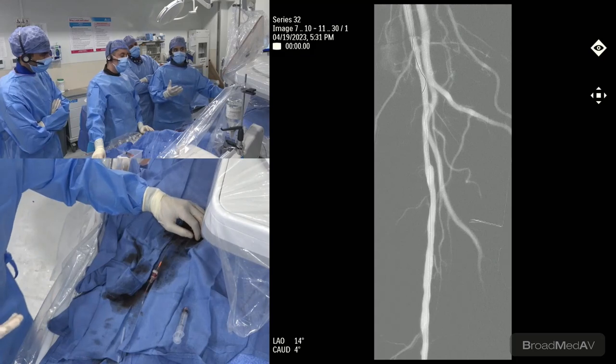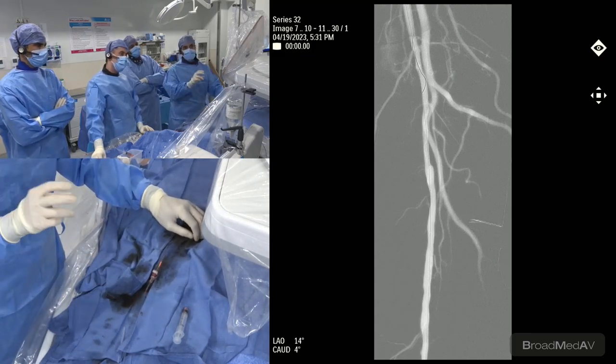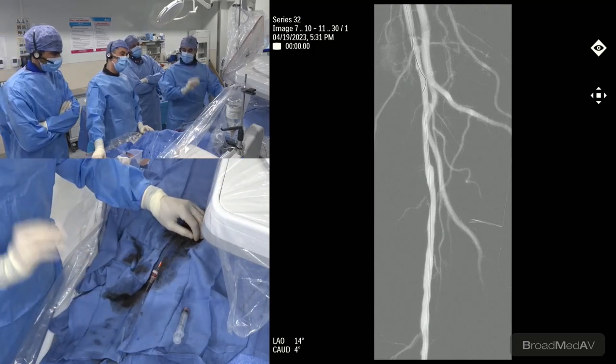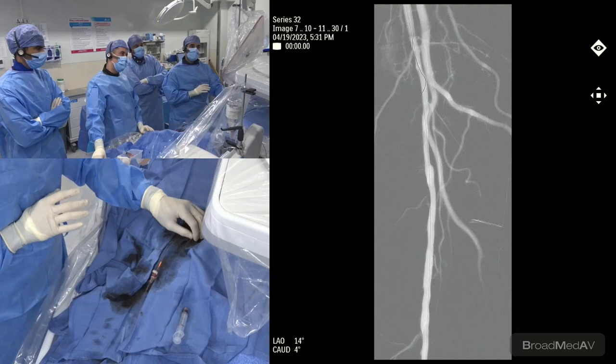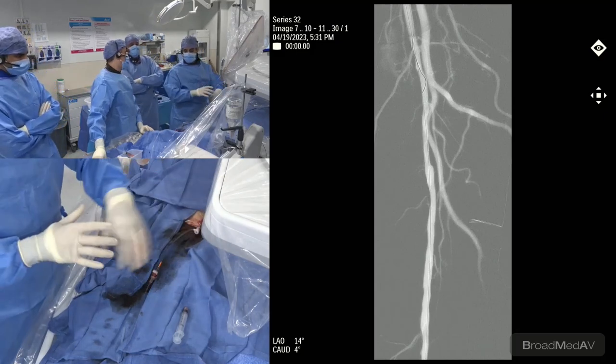And I think in this particular area, as you're saying, this is a high flexion point. This is where the SFA actually bends whenever you sit and all that. So I think over here, I would actually choose to do a drug-coated technology, followed by a Supera should it be needed. Okay, because of the adductor canal.